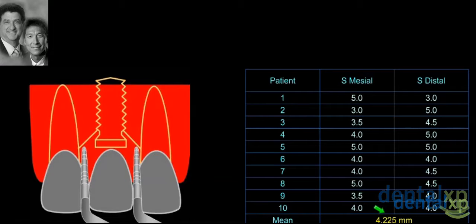So that's why everybody likes to show you single tooth implants. We'll show you single tooth implants all day. If the bone is good on the adjacent teeth, you're in great shape because you have all the attachment that you need. Next, please.